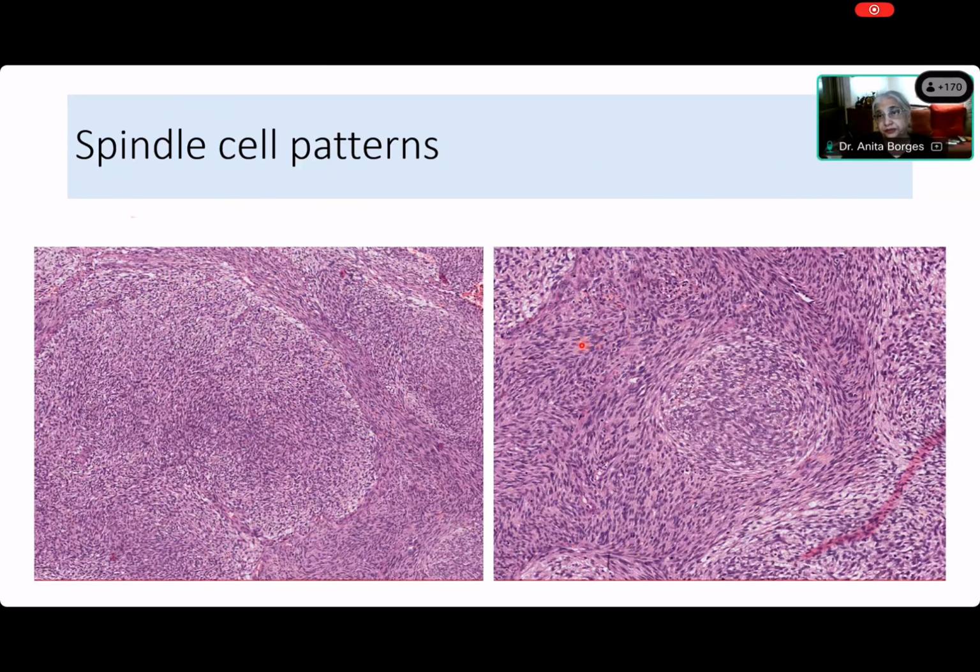I don't think so. It's a whorl. Okay, so you have identified that there are fascicles, and then you see some things which are not. They probably are fascicles, right? But what has happened to them? Look at this thing. We saw it where Shashank was saying, no, these are not spindle cells, because he didn't see the spindle nuclei. So why are you not seeing the spindle nuclei over here, Priyamada? Ma'am, these are, I think, transversely cut.